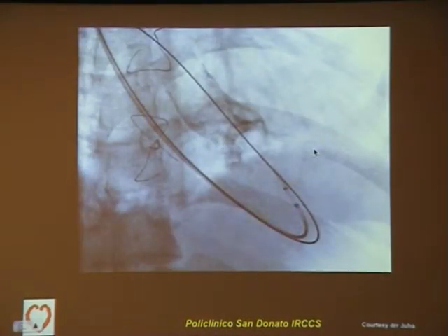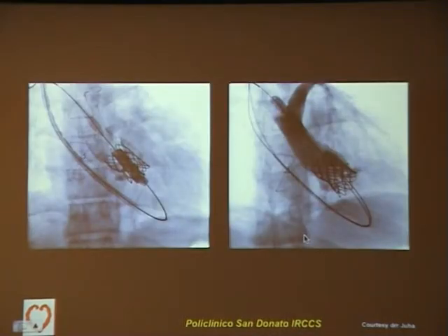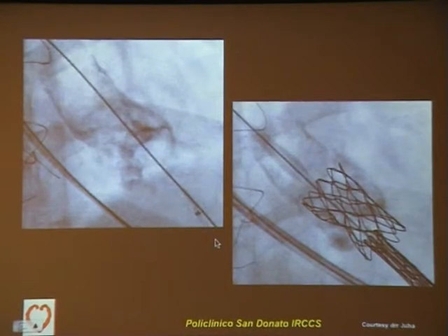That's an example of a heavily calcified conduit, as you see here, approached by jugular vein approach because of bilateral vein occlusion. This is a stent, the Melody, implanted, as you see, with excellent result. However, if you look at these two pictures carefully, you may notice a difference here. If you don't notice that, I can help you by putting an arrow where the calcium has broken.